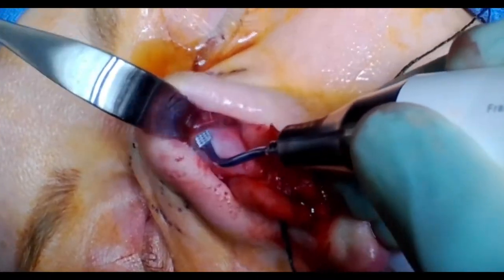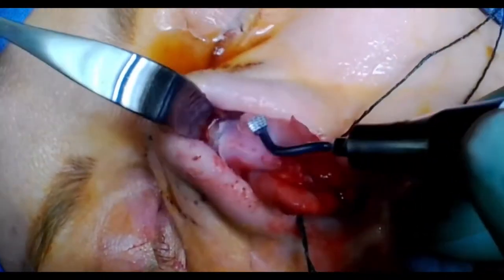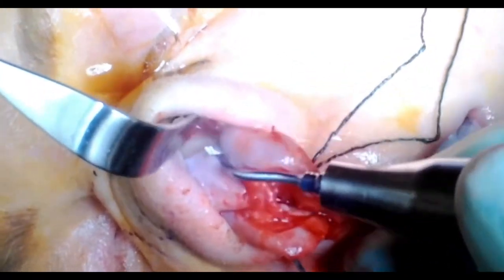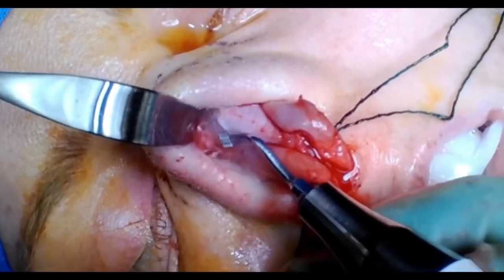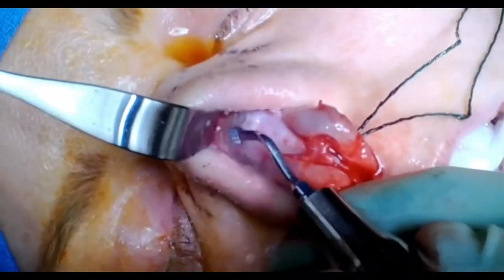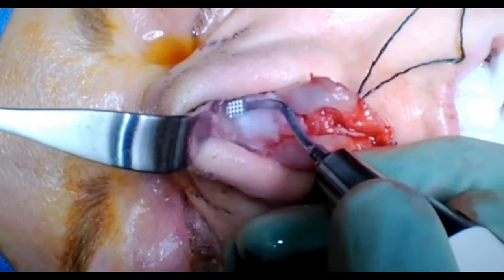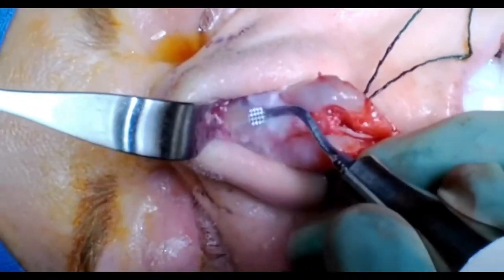Now we're using the piezoelectric device. This is an ultrasonic device. The tip vibrates and when it interacts with a firm surface like bone, it actually emulsifies the bone. The tip is cooled with a jet of saline. You can see the saline actually keeping the tip of the instrument cool. This is a rasp, so it's similar to a mechanical rasp that you would use to take down the bony cap and shape the dorsal and lateral keystone areas. But it's not mechanical pressure we're applying here — we're just allowing the instrument to slowly melt the bone away. It's a very efficient and very precise process. You don't have any sharp edges, you don't have any unintended bony fractures, and you can be very precise with how much bone you're removing. The retractor actually has a suction port in it, so as the irrigation flows through the tip of the instrument, it's suctioned out through the port in the retractor.